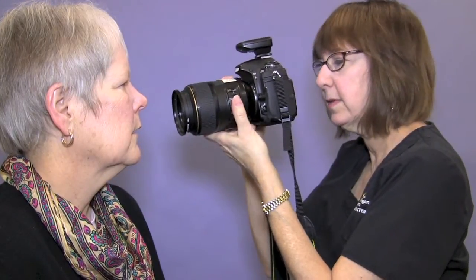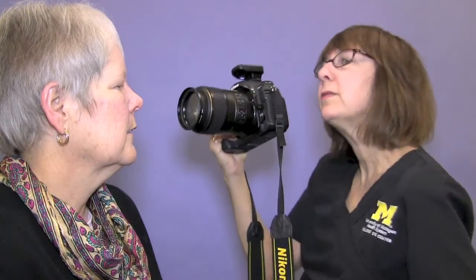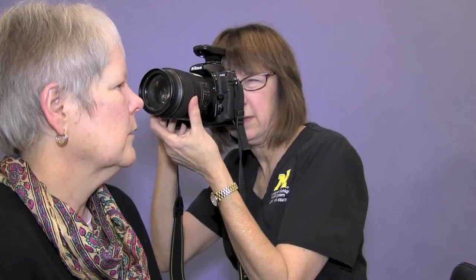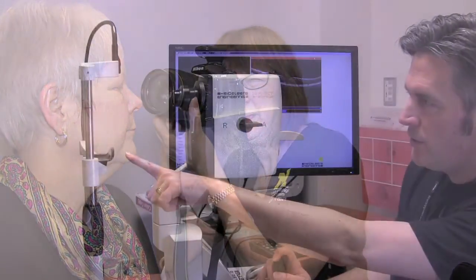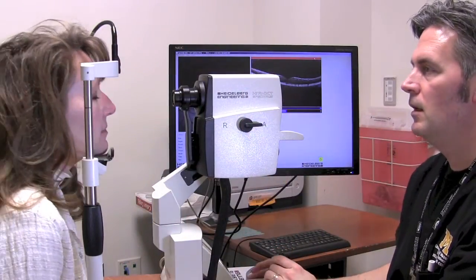We may also take photographs on a 35mm digital camera. In either case, you will see flashes of light, just like a regular camera you would use on vacation. For other conditions, we will need to capture images of the inside of the eye.